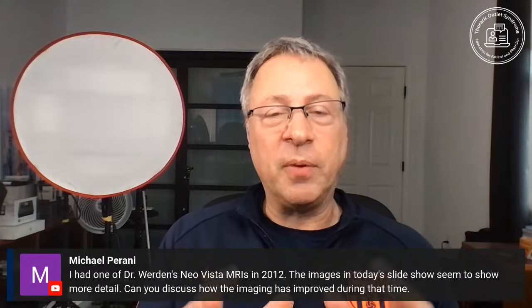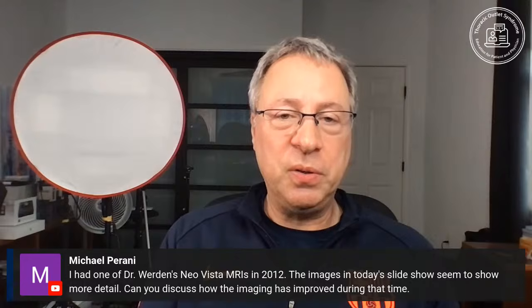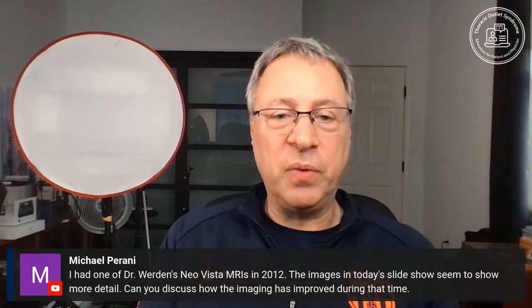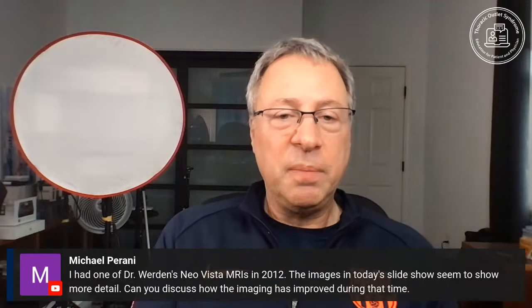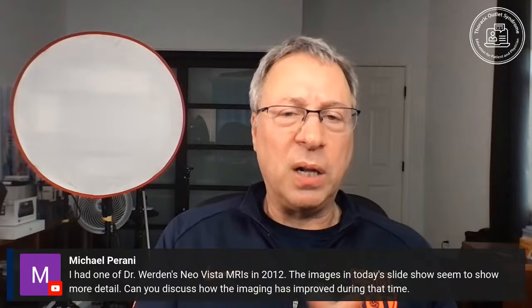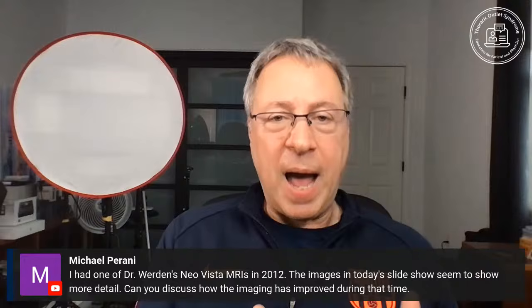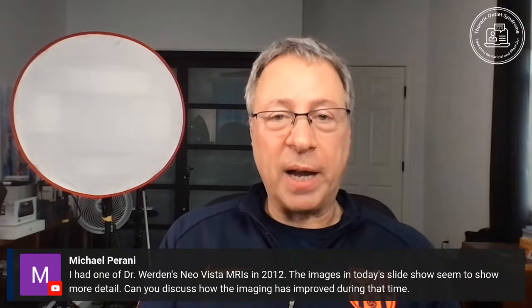We've also changed some of the MRI parameters to help separate out the different soft tissues. We've changed the order in which we do each series, which allows us to make some things work to our advantage. But overall, while I don't intend to stop improving, I'm happy that we're pretty darn accurate.